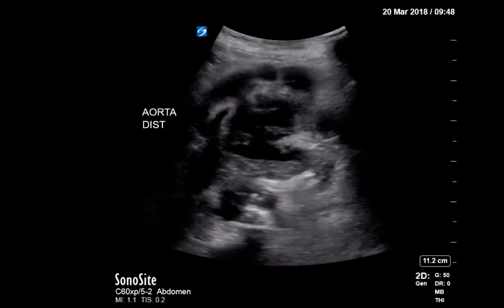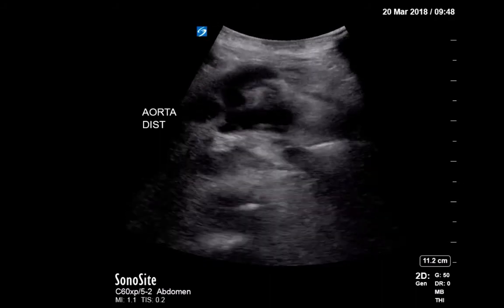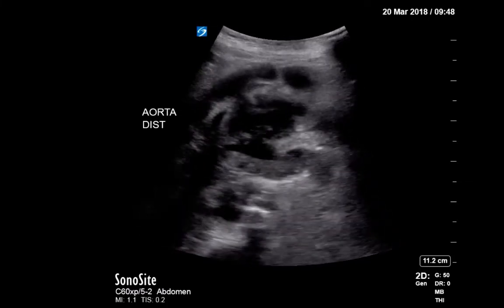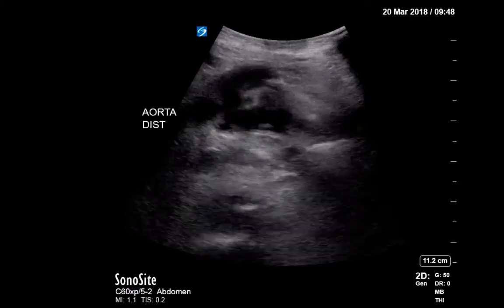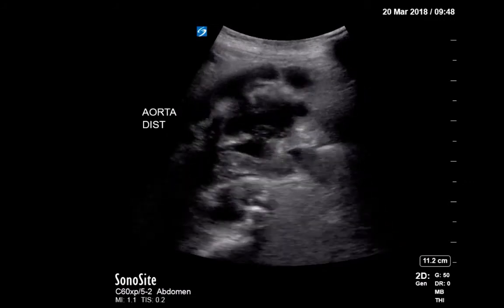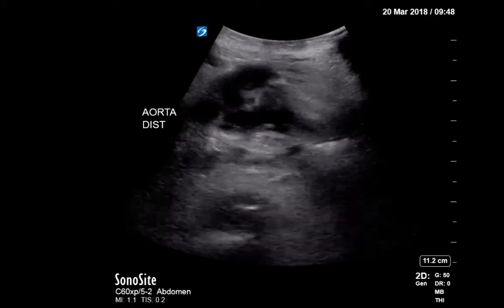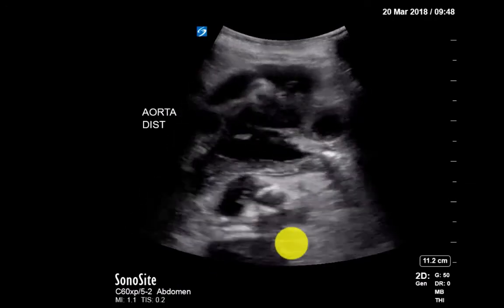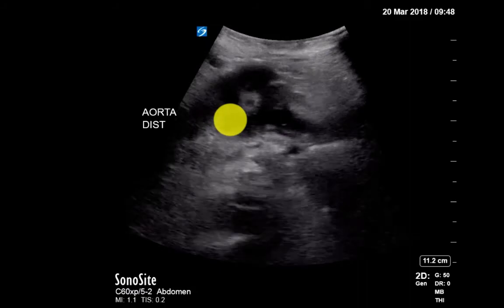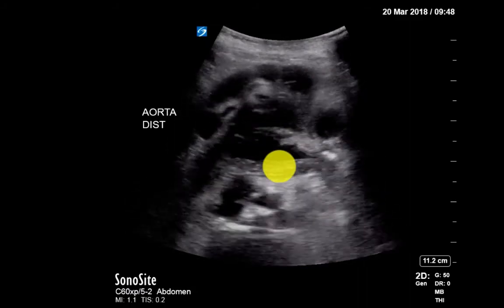This is a case from not quite a year ago we had. This lady came in with abdominal and back pain. Folks taking care of her were worried about the possibility of a AAA. They threw the ultrasound probe down. They are seeing vertebral body back here, and they're seeing this big mess going on in the patient's abdomen.